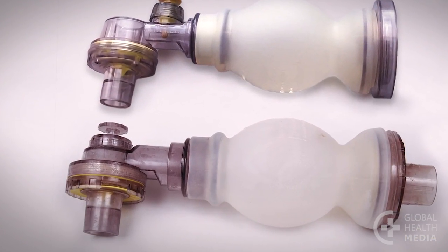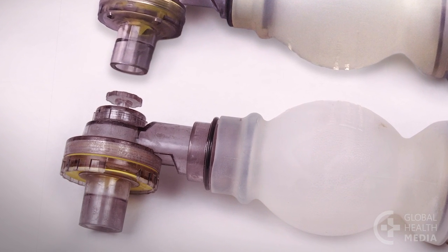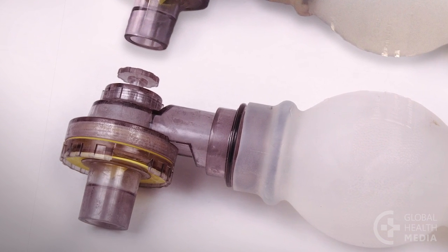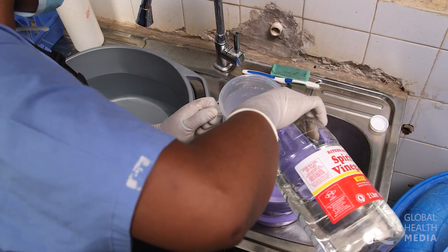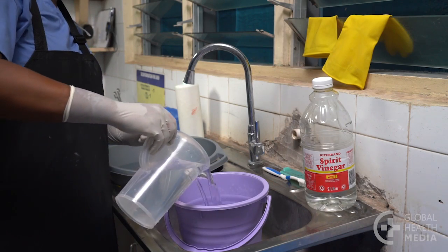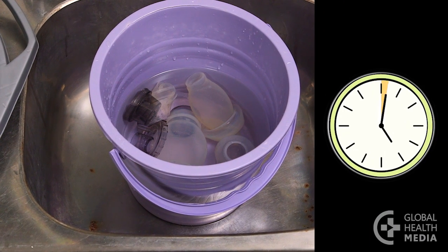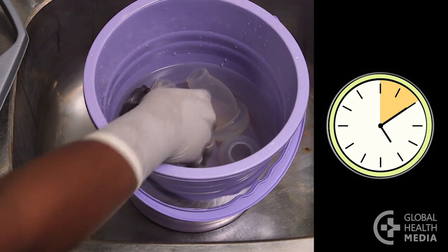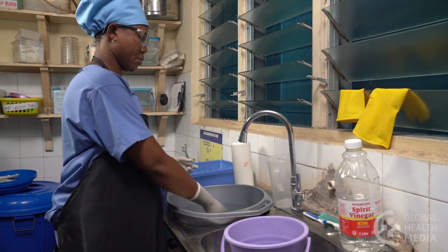If you see a light chalky material on the equipment, it's likely to be a buildup of minerals and should be removed. Make a solution of equal parts water and white household vinegar. Soak the submerged parts in the solution for 10 minutes. Then rinse them in a bucket of clean water until they no longer smell of vinegar.